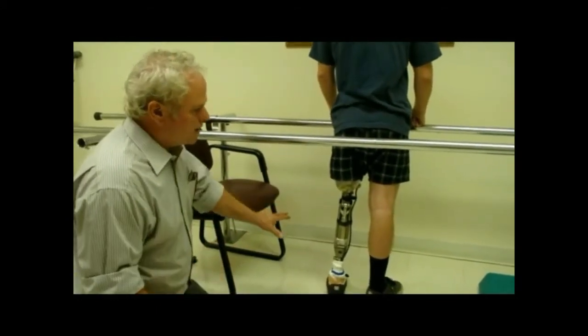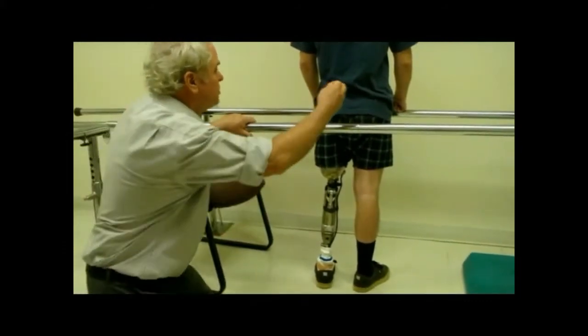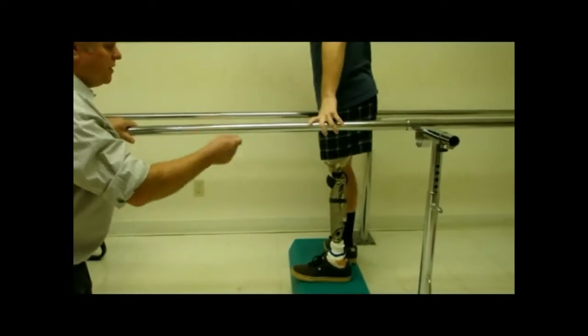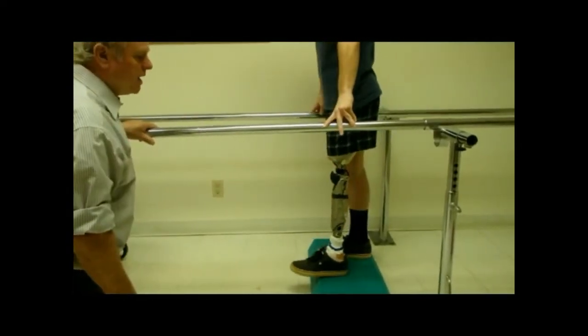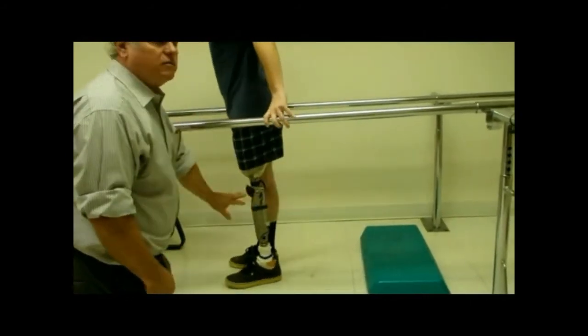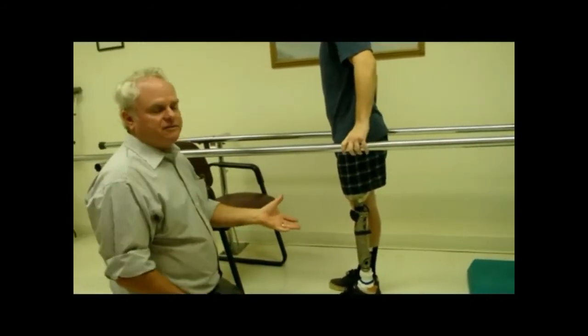So the first thing I'm going to do is I'm going to have them try this low step. So if you get on top of the step and turn around, there we go. Get your foot about halfway over the step. Now I want you to bend the knee and come down. Notice he didn't ride it. It was kind of stiff.